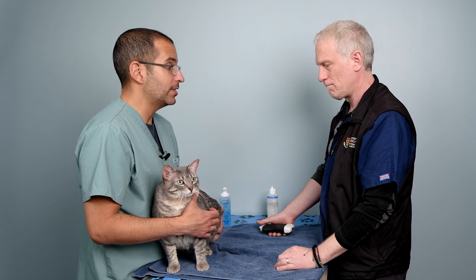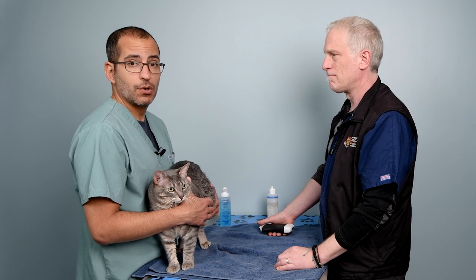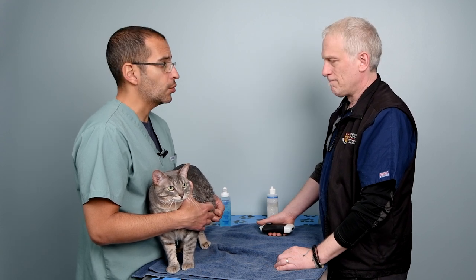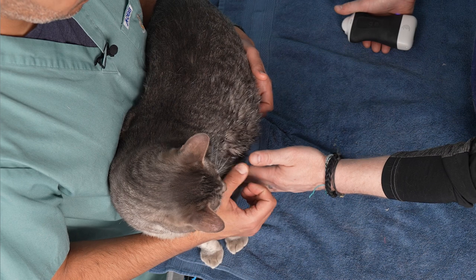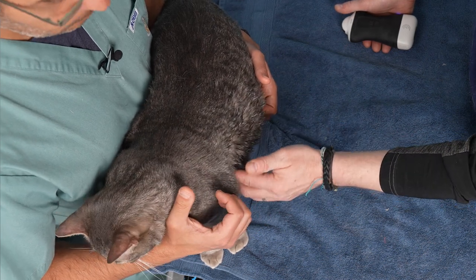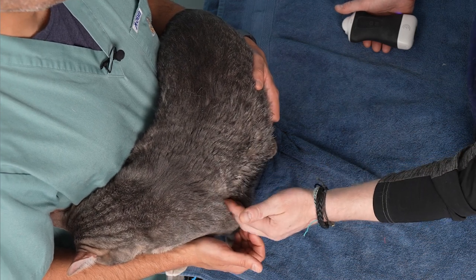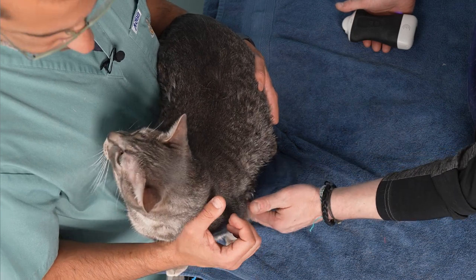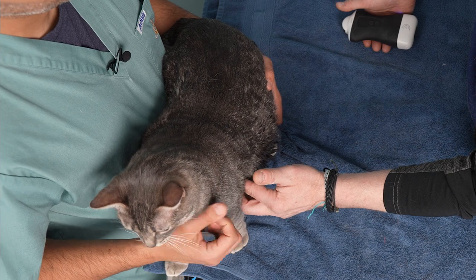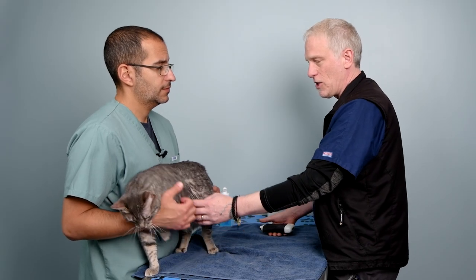We're going to show you where we start with the probe as well. Using those borders and all the pathologies we're going to be looking for, we're going to go border to border to border to border. No memorizing ribs, no counting ribs, no memorizing any protocols — just using clinical knowledge. That first border we're going to talk about is right behind the front limb. If I can palpate the front limb and feel a rib space behind it, that is essentially going to be our cranial border. If we lift the limb forward or pull it out a little and tuck the probe into the axilla, we can expand that cranial border. Essentially, that cranial border is as far forward as we can scan before we hit the scapula and the flexor muscles of the shoulder.